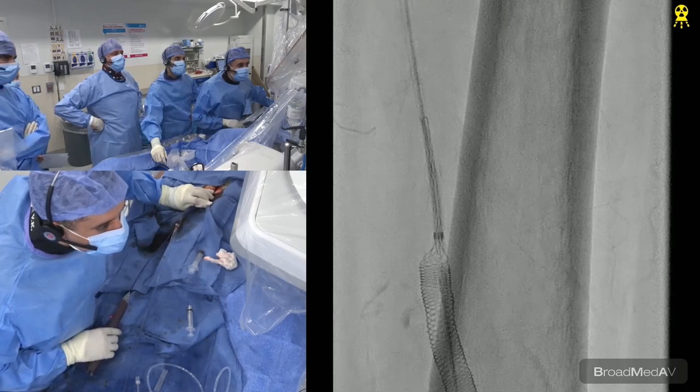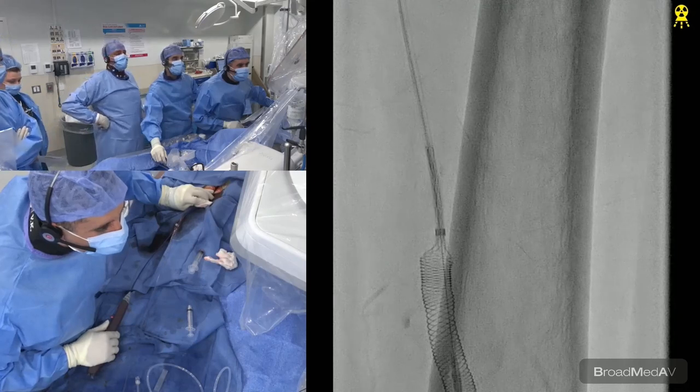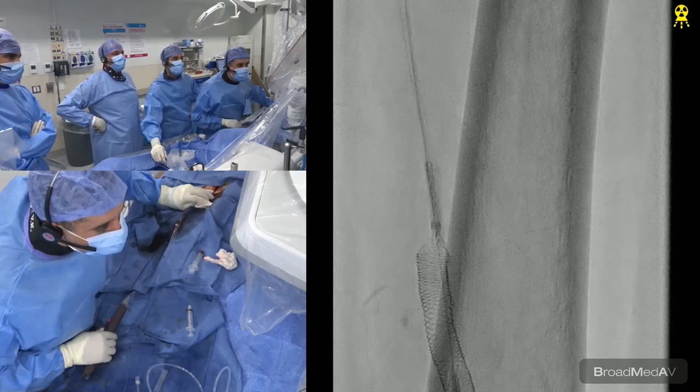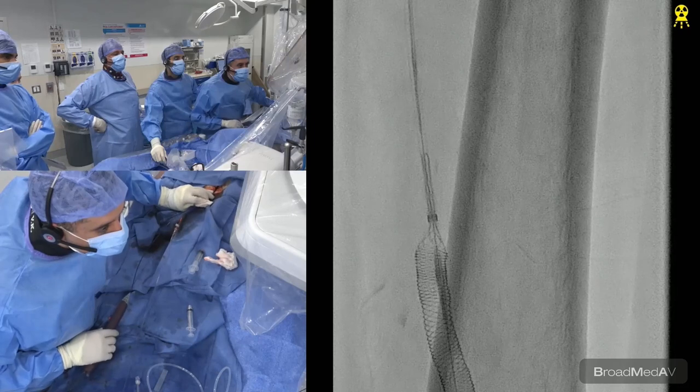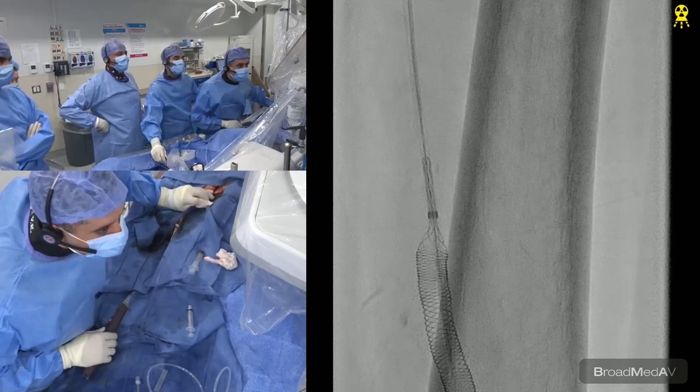Beautiful. So you can see here, Vishal is doing such a phenomenal job. Roman did a great job crossing. And the IVUS discussion was phenomenal. So we have 10 minutes left. Now you need to elongate a little bit, brother. Yep, pull it. See, and Supera is conformable, right?